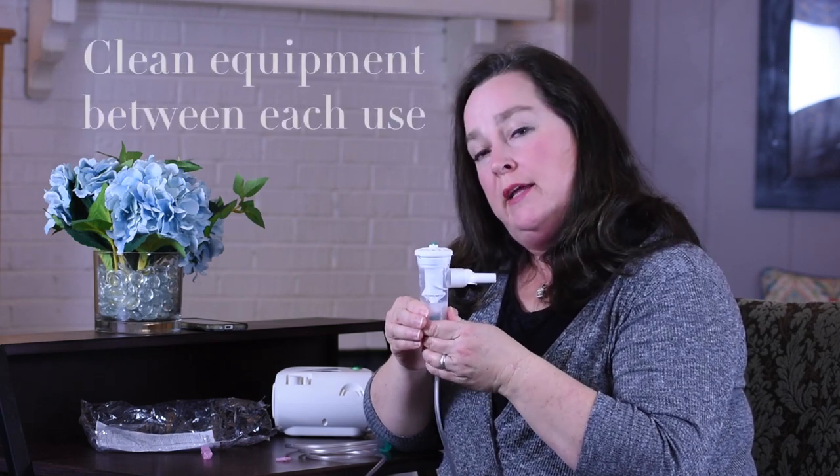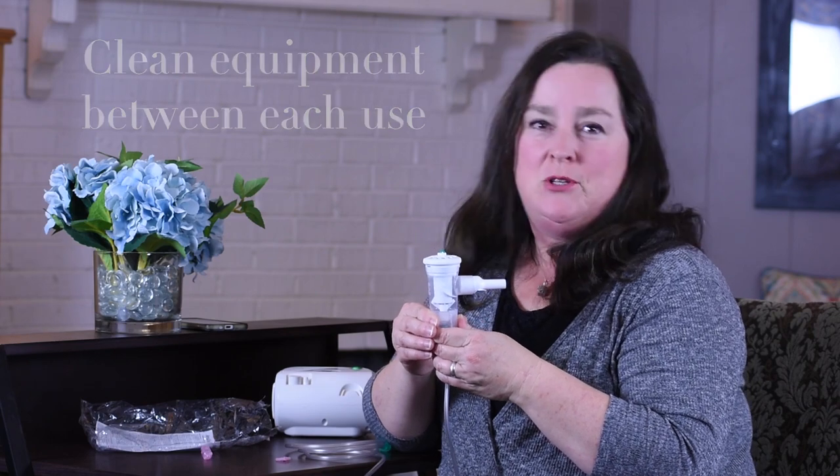Then you will want to make sure that you clean your equipment thoroughly between each use. That is demonstrated in a separate video.